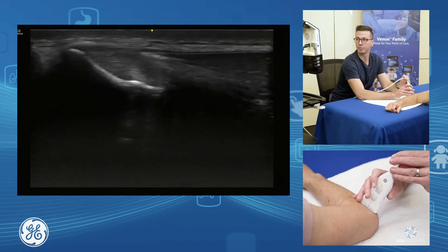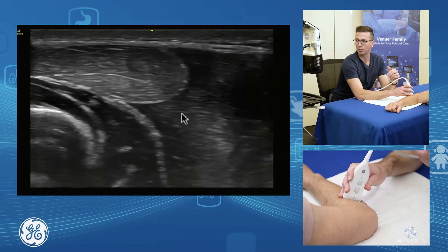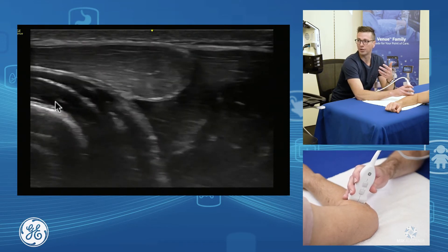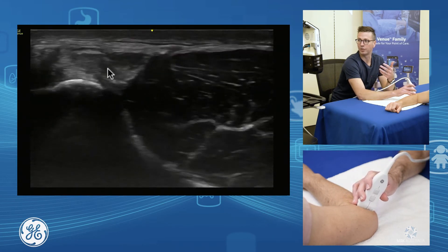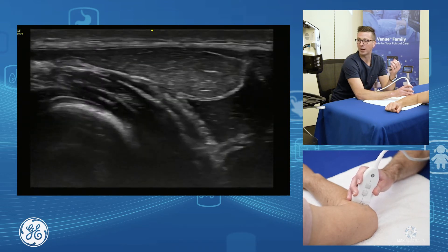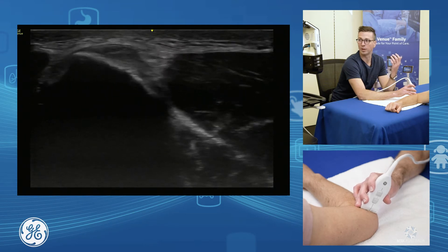You can also assess it in short axis. If I bring my probe down towards the patient's hand and come down through here, I can see the muscle — primarily our extensor carpi radialis brevis, with extensor digitorum communis sitting on top and our supinator underneath. As I bring my probe back up proximally, we see our ECRB fibres coalesce to form the main part of our common extensor. So that covers short axis — from back towards the musculotendinous junction and up towards the tendon enthesis.